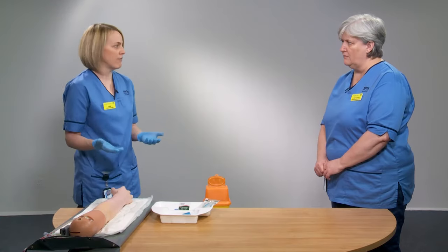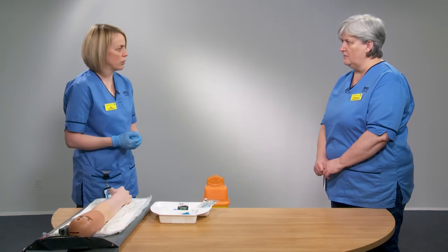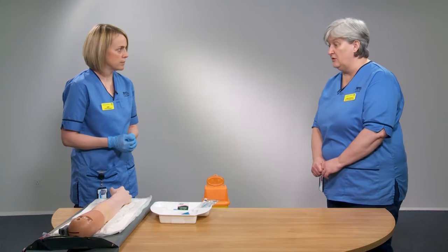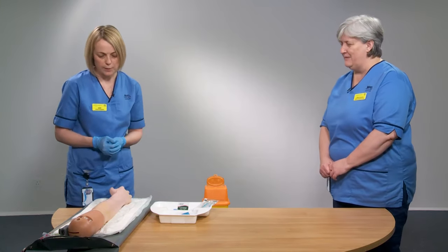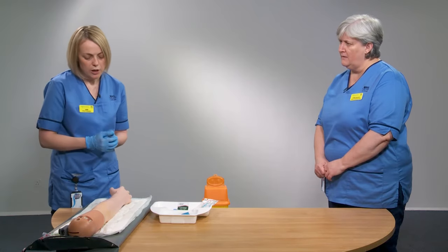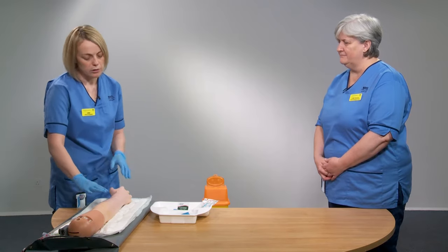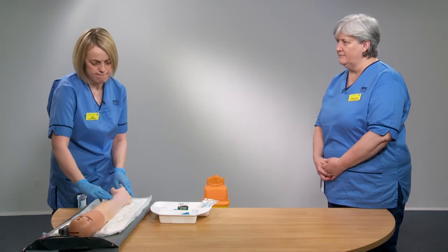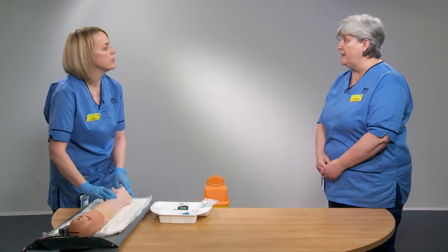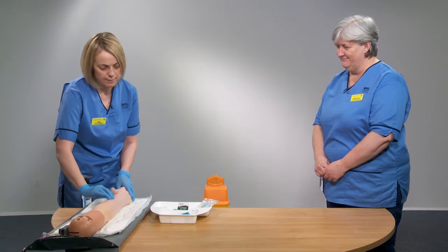For all procedures with patients, we need to obtain consent in the normal way for any clinical procedure. Also make sure the patient is comfortable — patient comfort is very important. Once you've explained the procedure, look and feel for a good vein. A good vein is bouncy, refillable, you can feel its direction, and importantly it does not pulse.